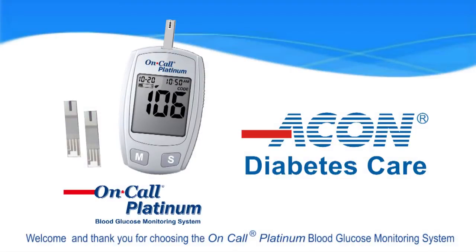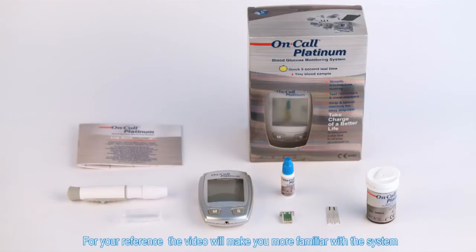Welcome and thank you for choosing the on-call platinum blood glucose monitoring system. This video will make you more familiar with the system.